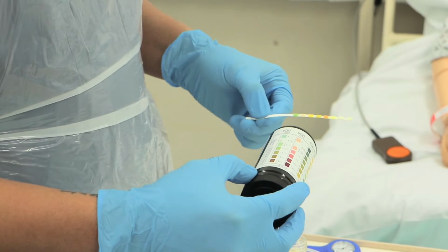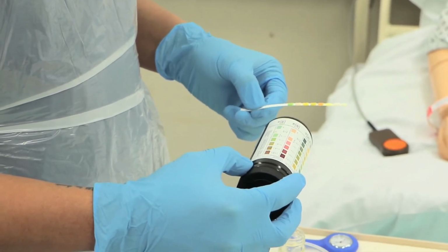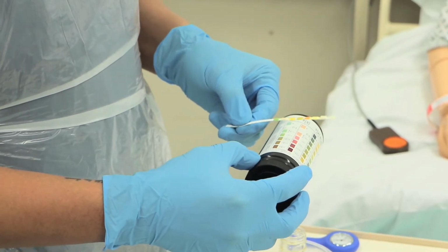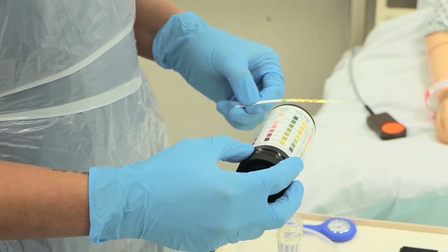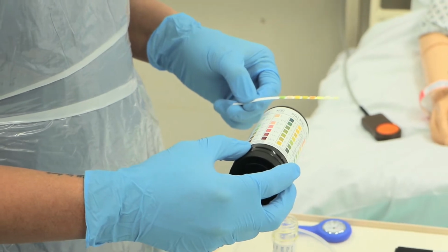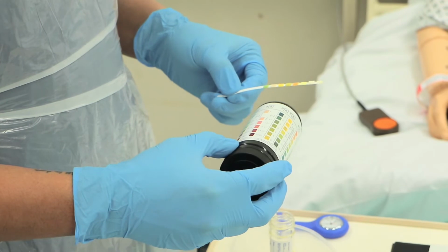25, 26, 27, 28, 29, 30. Glucose is 2 plus. Another 10 seconds for ketones. 1, 2, 3, 9, 10. Ketones is negative.